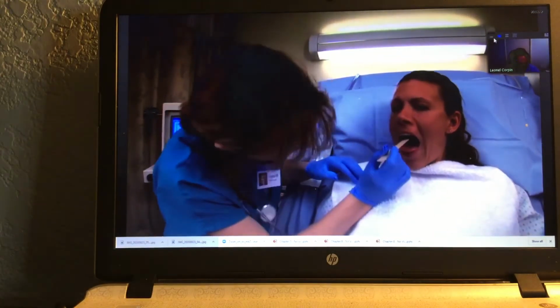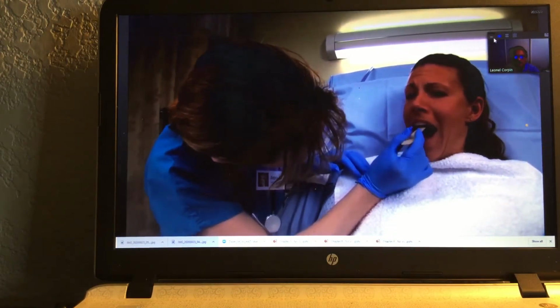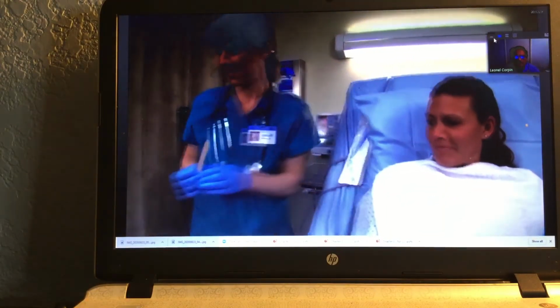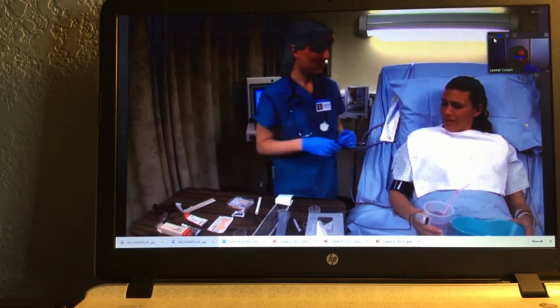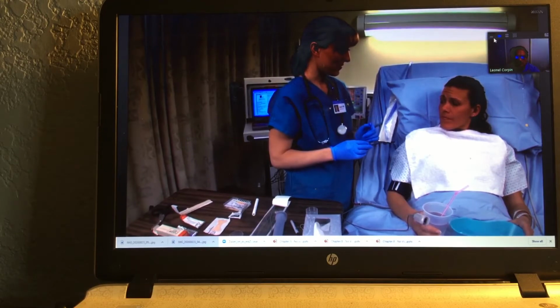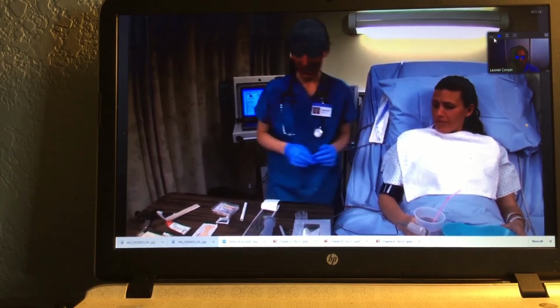Go ahead and open your mouth. Say a big ah. Okay. Now we talked about communication while I'm inserting the tube. I want you to go ahead and raise your index finger if you're having any discomfort or want me to stop at any time. Okay?